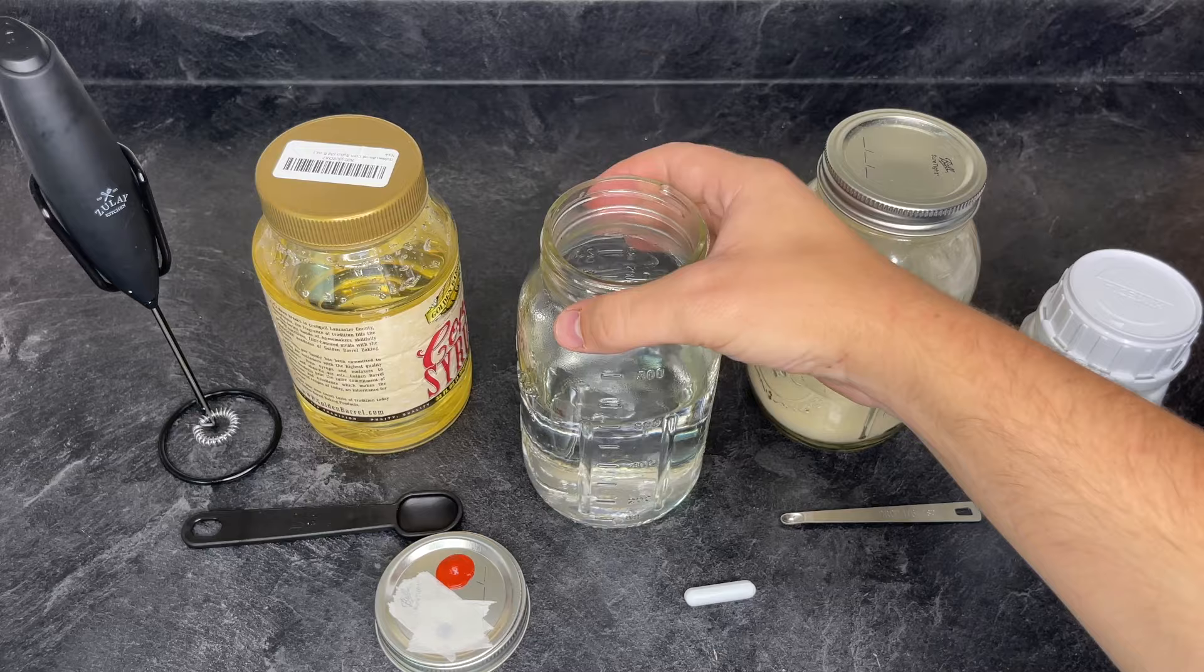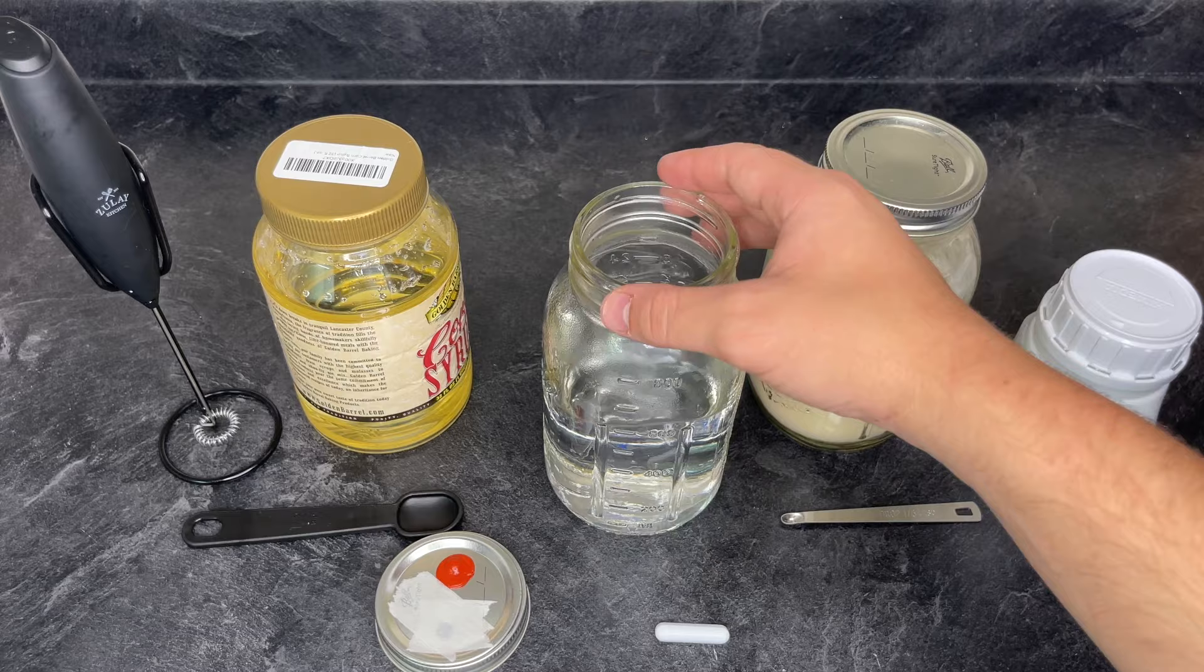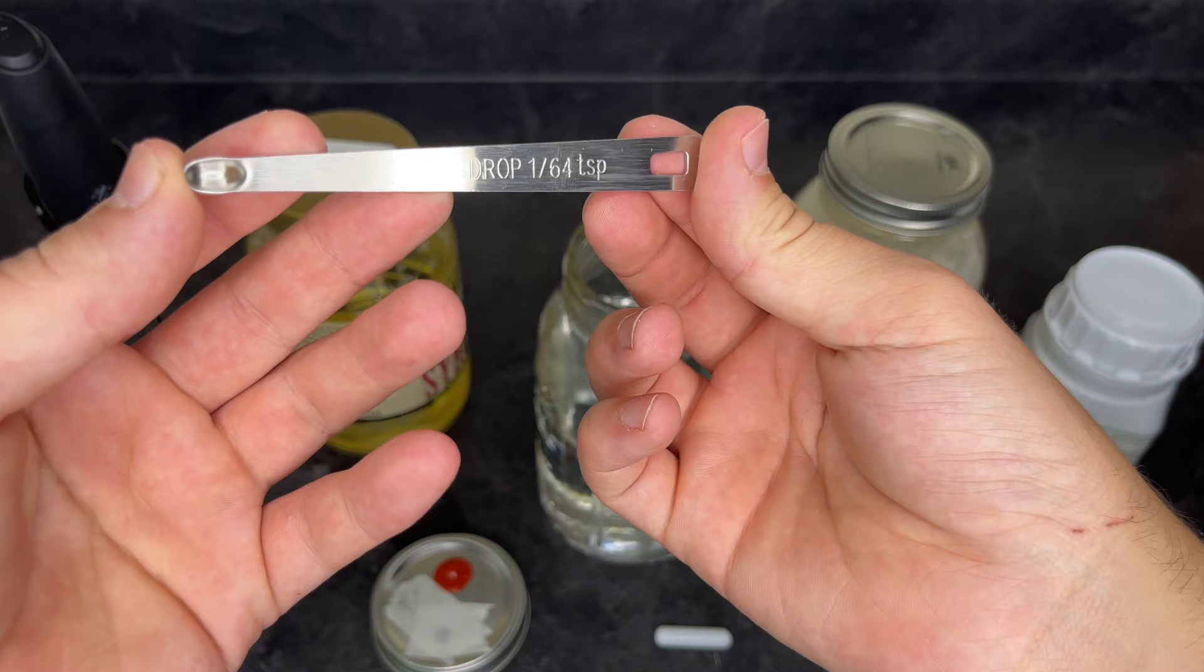After making many different batches and comparing them, I found the best measurement for me was 1/4 teaspoon of the light malt extract and peptone into 600 milliliters of hot, distilled water.